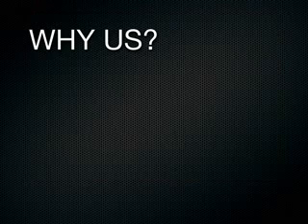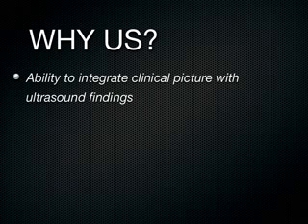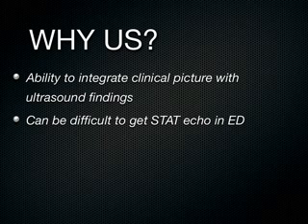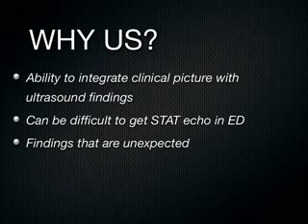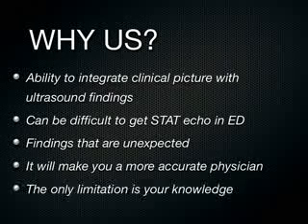So that's a good reason to think about why we should be doing cardiac ultrasound, because we have the ability right there to integrate the clinical picture with the ultrasound findings. We know sometimes it's difficult to get cardiology to come down and do a stat echo, depending on the time of day. And by stat, maybe it gets done in 15 minutes, maybe 20 minutes. I don't know. Stat for me means in the next 60 seconds. In that patient, it was an unexpected finding that we had. And I think all that makes you a more accurate physician, the only limitation being your knowledge.